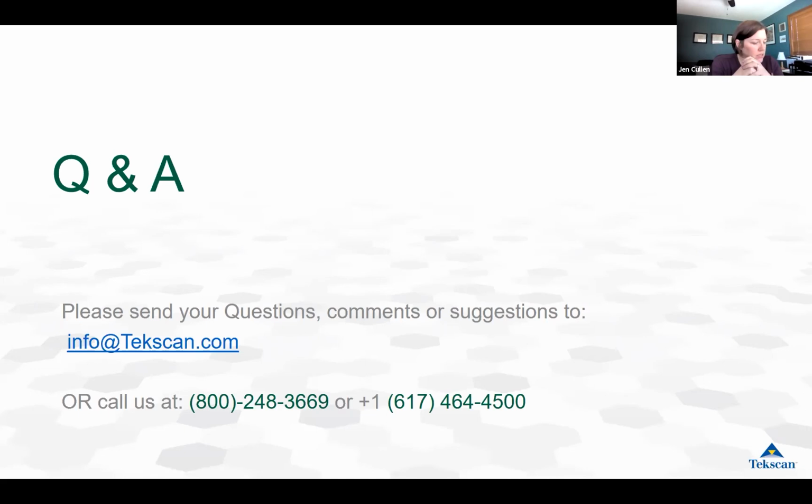The next one that relates to that actually is, I know we had mentioned this in the webinar, but the question came up around: if someone buys T-Scan Novus Core and they decide that they want T-Scan Novus, they want to upgrade, can they upgrade? What does that look like? Do you want to approach that one?